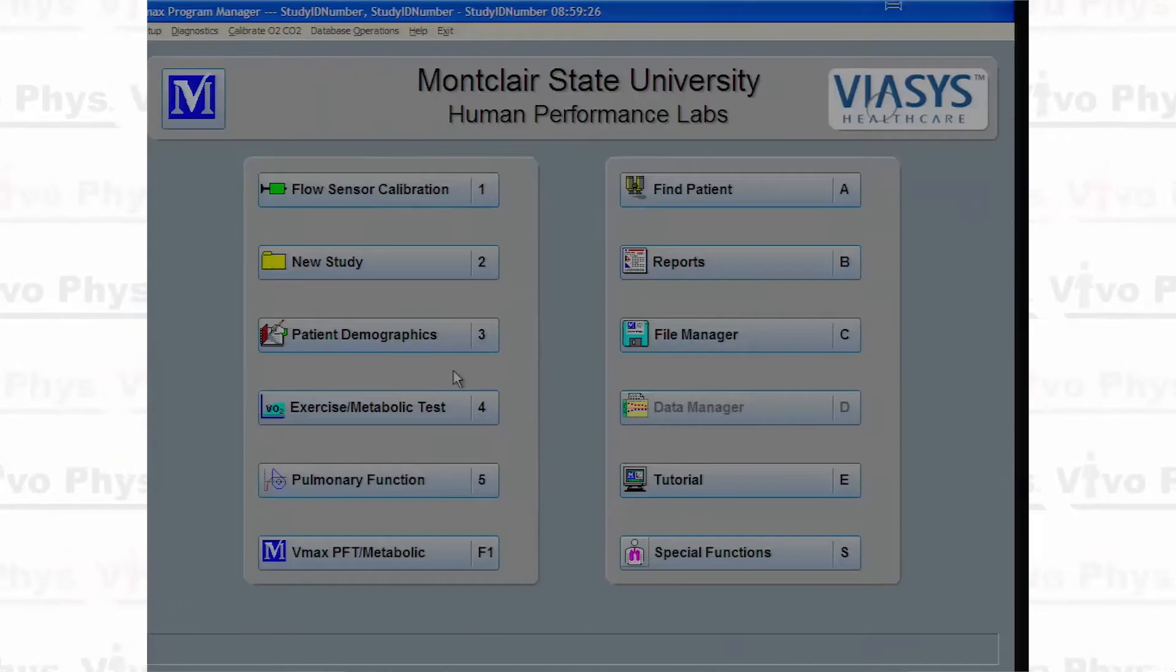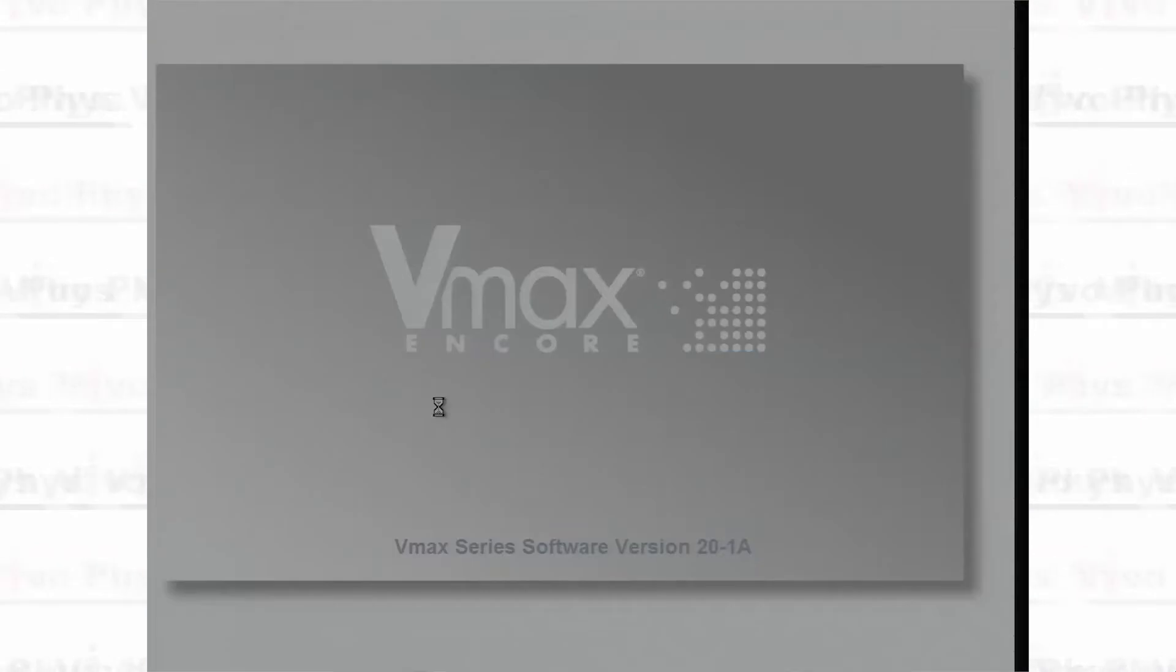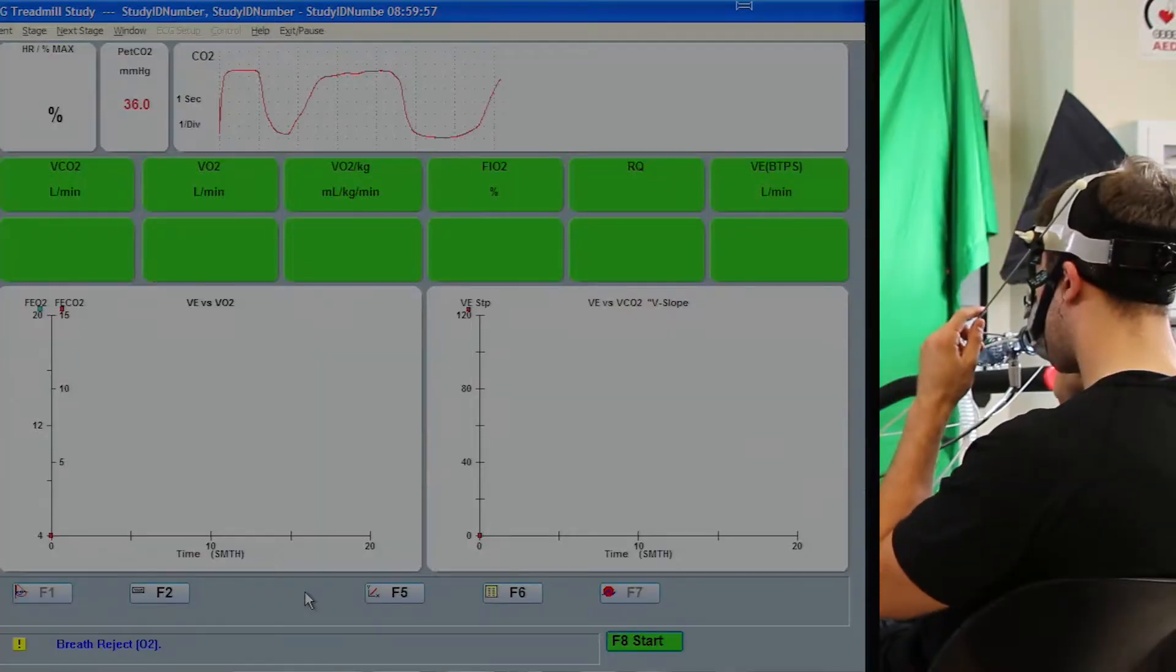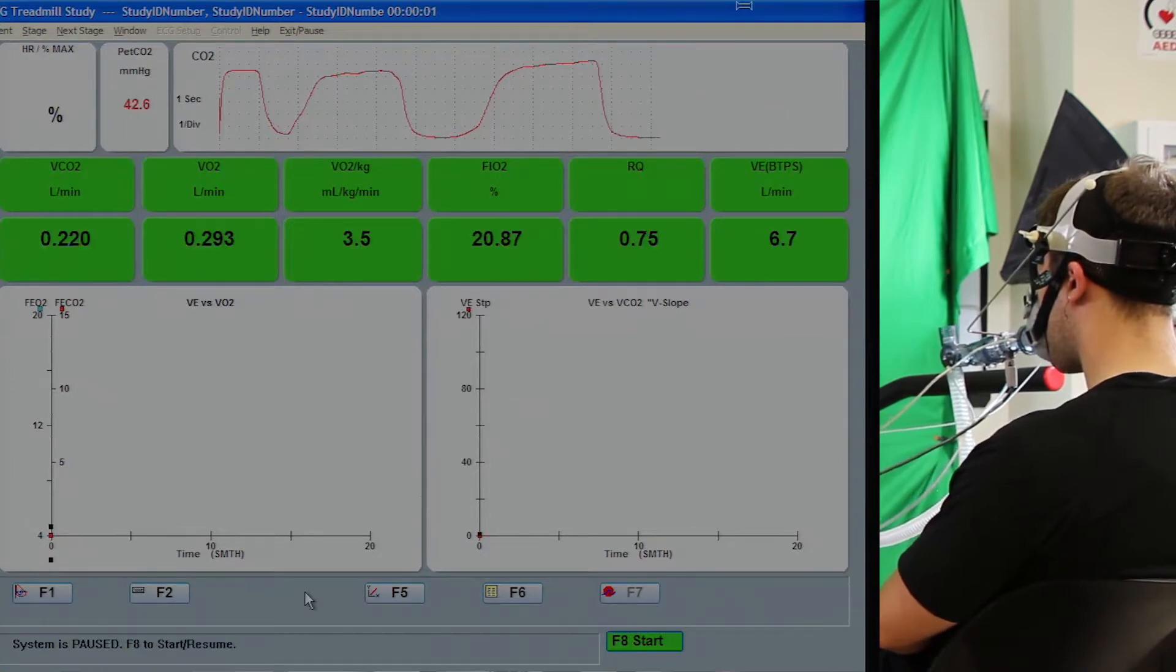With the participant's information entered, go and click on the exercise metabolic test and it's going to pop something up. Click start test. From that menu, hover across the bottom of the screen over those buttons and look for the one that says exit and begin test. The screen will show you the different parameters that are going to be measured during the test.